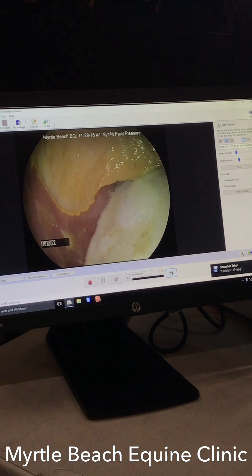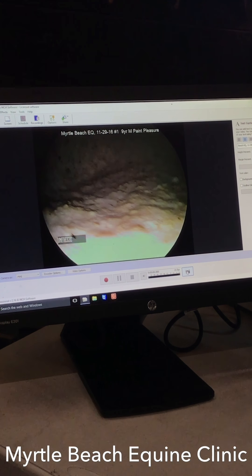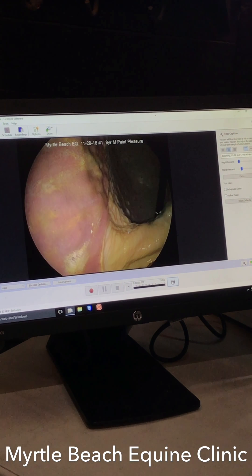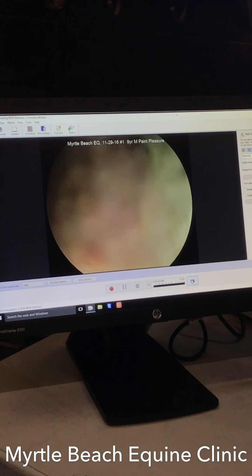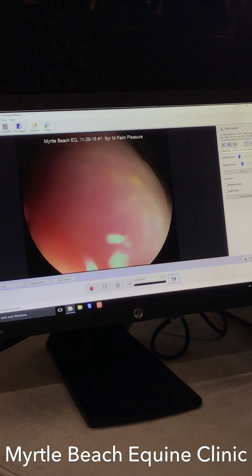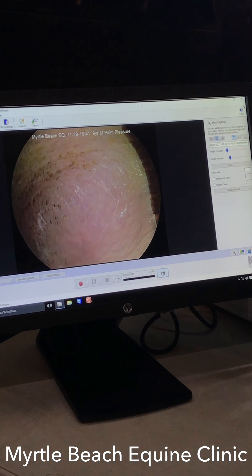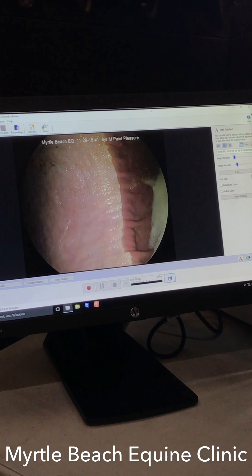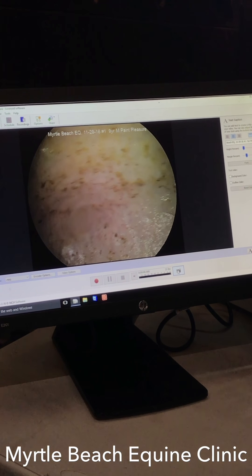I'm not seeing anything other than a slight yellow discoloration to really say that she's having too many issues. We looked up at the top just to be thorough — not much going on up there either. So I'd say she's not too bad. She came back from NC State and was on one GastroGard — that was back in May, about two months ago, for a few days. But other than that, not too bad.